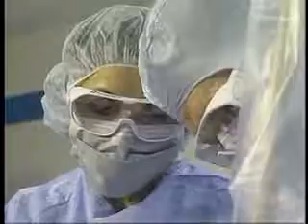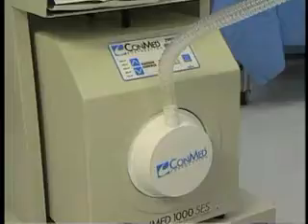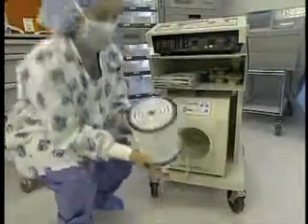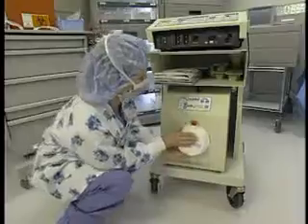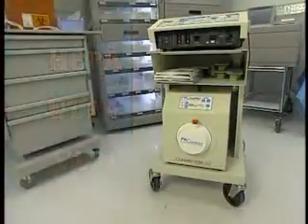Filters vary from brand to brand. The efficiency ratings are important. HEPA is rated at 99.97%, whereas ULPA and VLSI filters have a much higher efficiency rating. Carbon filters are used primarily to control odor. Filters should be changed according to the manufacturer's instructions. They are to be treated as contaminated material and disposed of accordingly. Be sure to wear a mask, gown, and gloves when handling used filters.